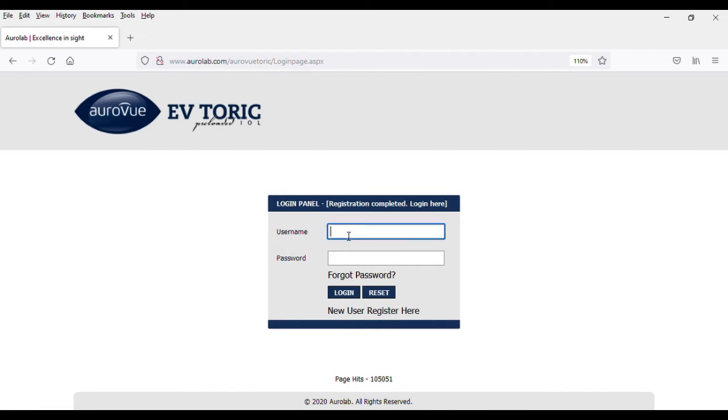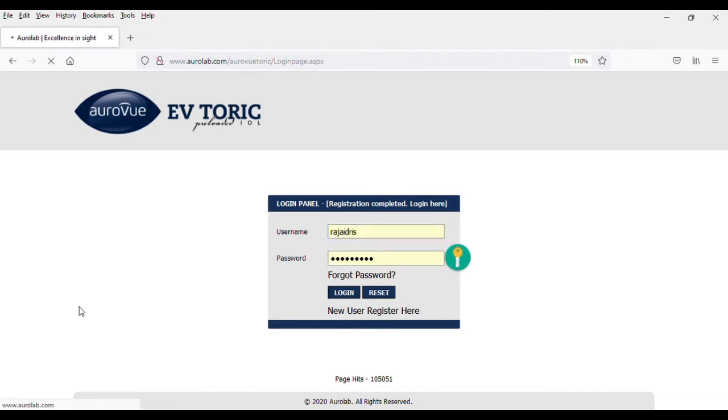Now, on the login panel, re-enter your username and password.